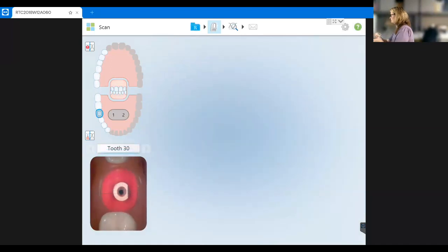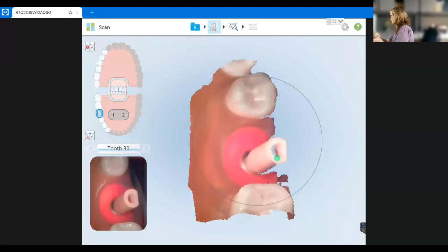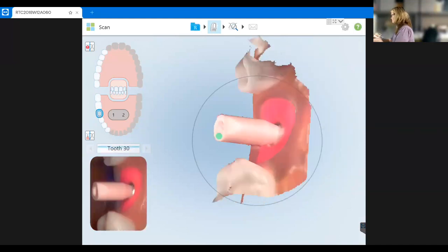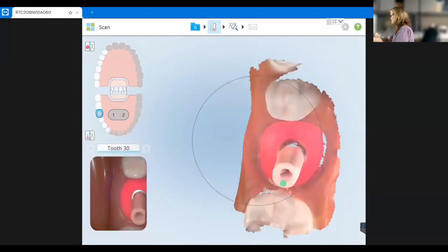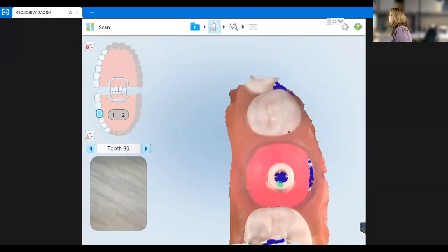And it's occlusal, then lingual, and then buccal. I'm going to try to get a little bit more of the walls, both distally and mesially, and turn it off. So we talked about that green dot, right? I think having the green dot here on the buccal a little bit is just perfectly perfect.